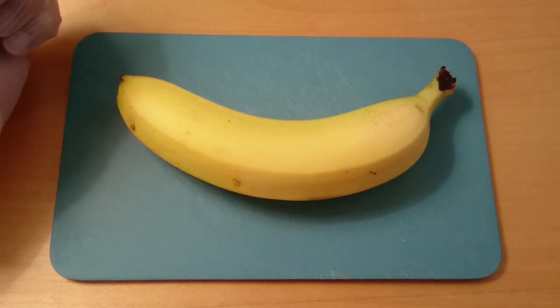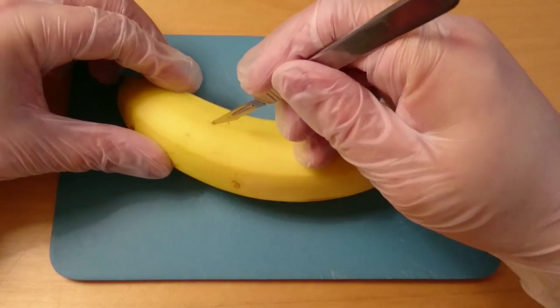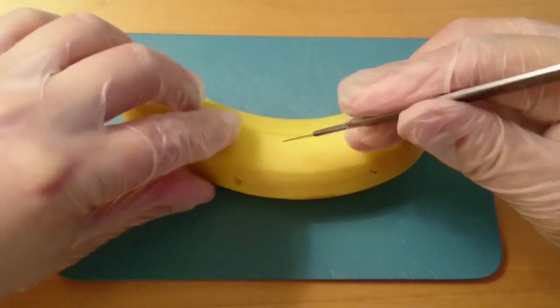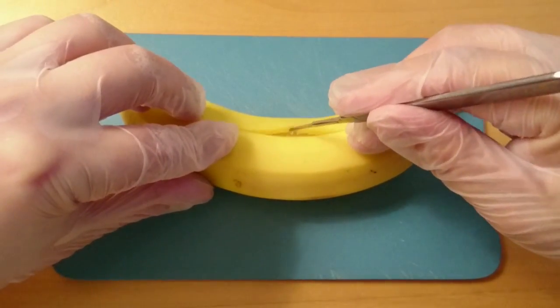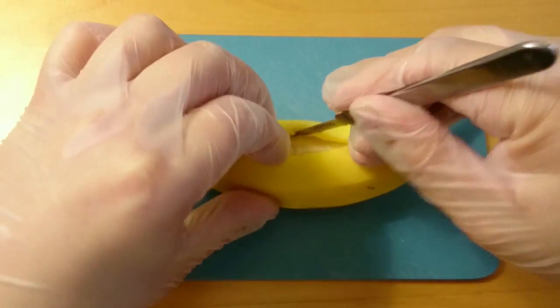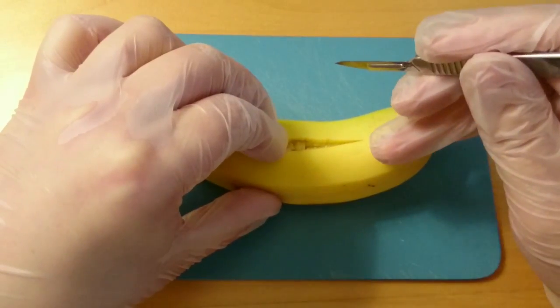Start with preparing the banana, just making an incision and picking out the pulp. This is a little bit tedious, so I'll make a jump cut.